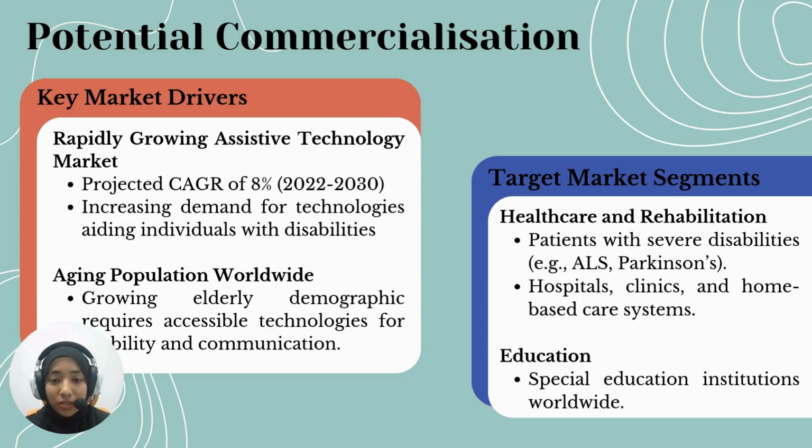Another significant driver is the aging population worldwide. As the elderly demographic continues to grow, there is a pressing demand for accessible technologies designed to improve mobility and communication. These trends position solutions like OptiCom to meet a critical market need, empowering users and addressing societal challenges effectively.